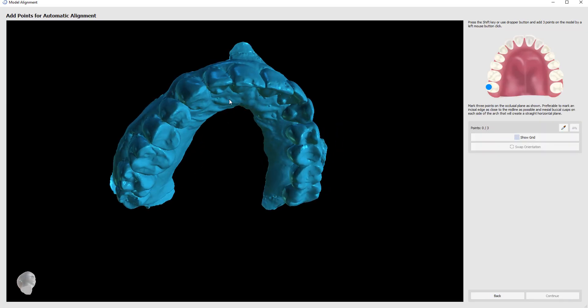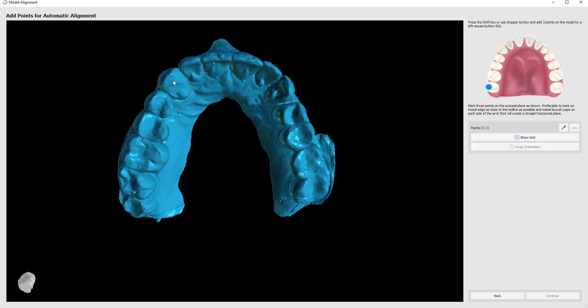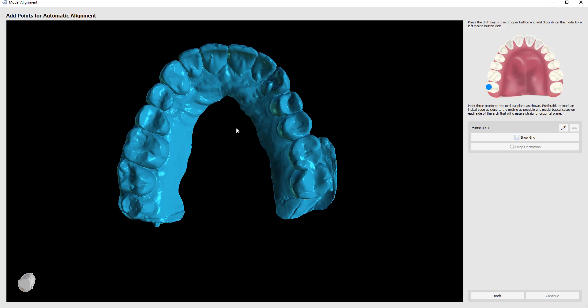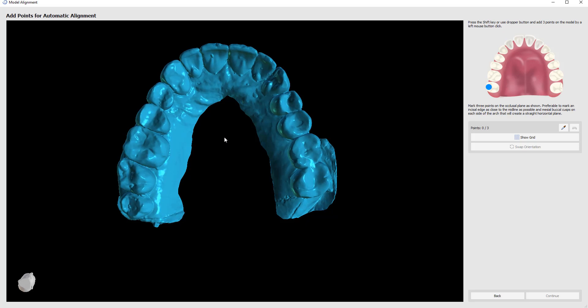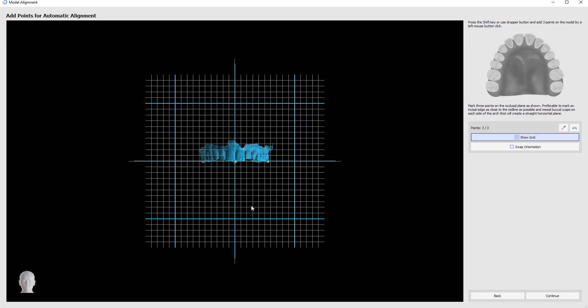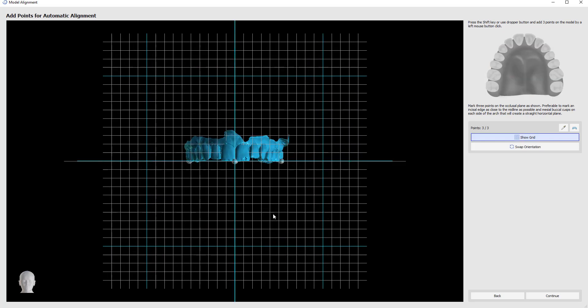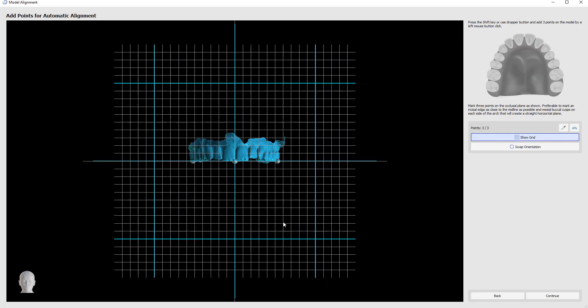We're going to mark three points to create a horizontal plane. Hold down the shift key, left-click on the first, left-click on the second, which should be as close to the midline as possible, and then left-click on the third. The software automatically aligns the model to the grid and we can click continue.